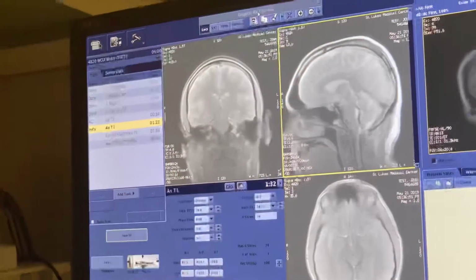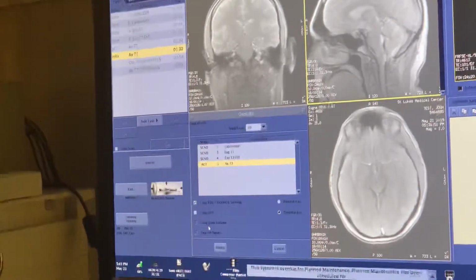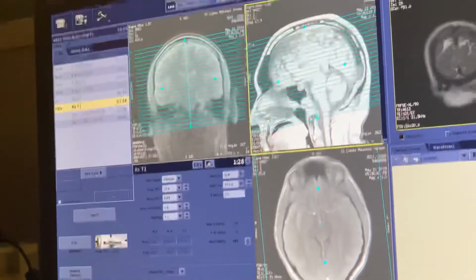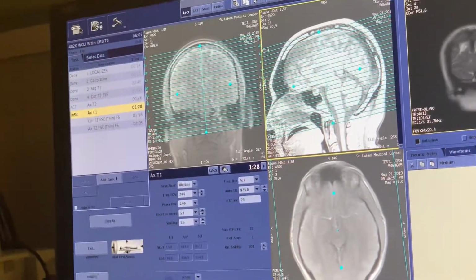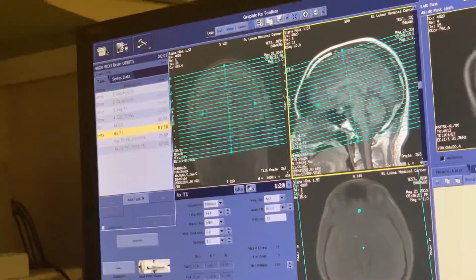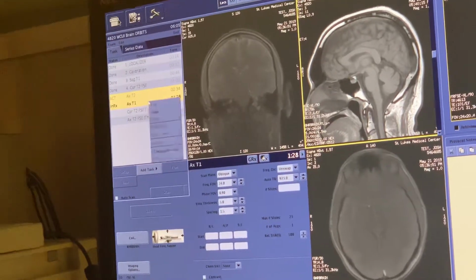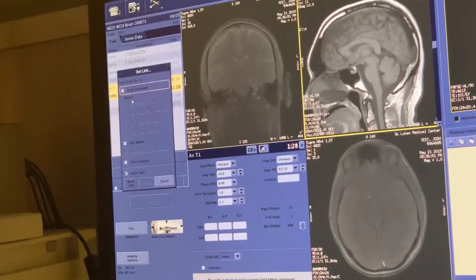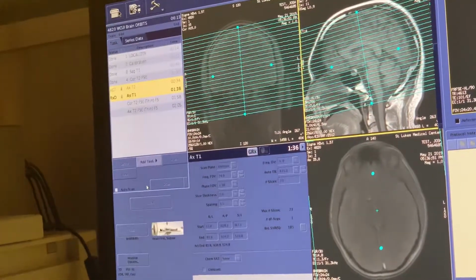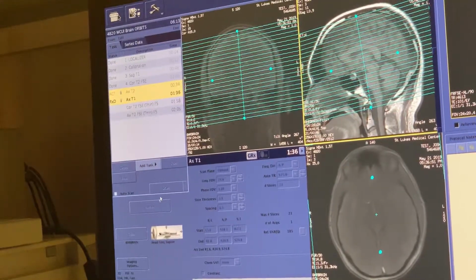So we can copy it, right? So I come over here. You can either copy it directly like this, or you can link it. So if I don't, I can do this. So this copied directly off the last scan, which is fine. Or if I feel like it, I can just select this one here, select this one, right click, create an edit link. I can click that, hit accept, and it does exactly the same thing. Either way, I prefer to just copy them, but if you want to link them, you certainly can.